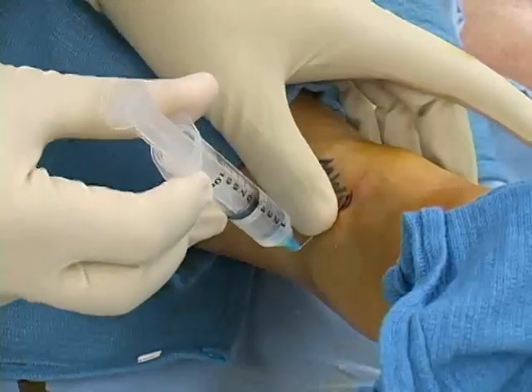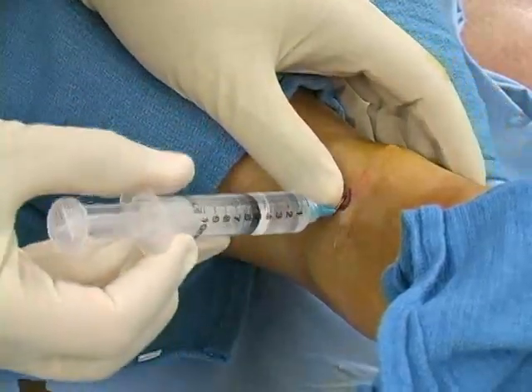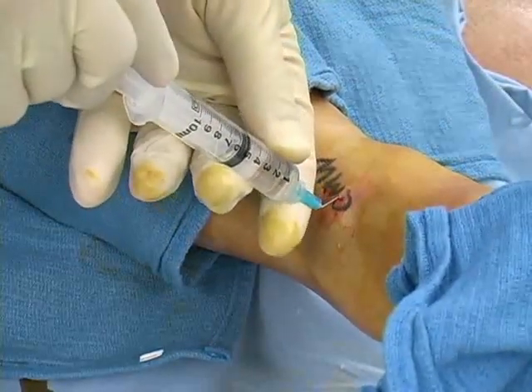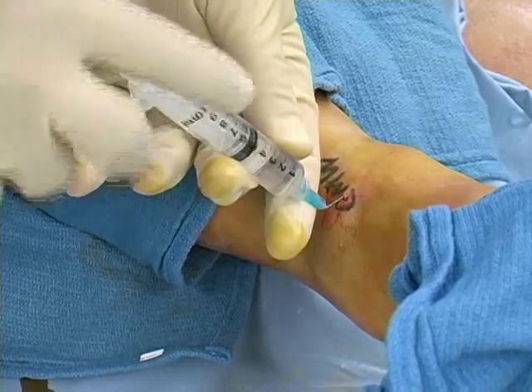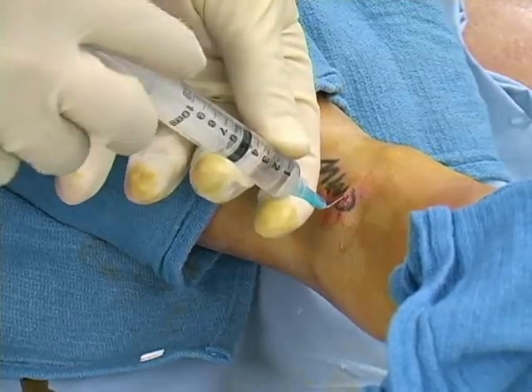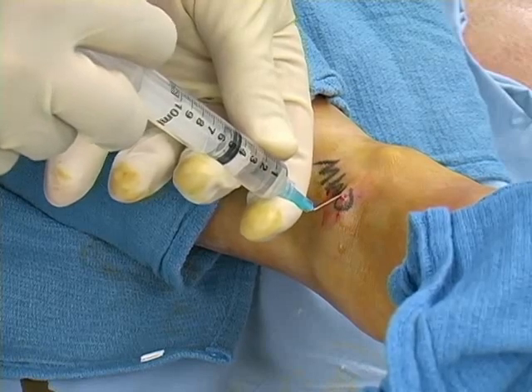Redirect the needle, this time toward the medial malleolus. In a technique similar to the superficial peroneal block, inject five milliliters of local anesthetic, starting at the medial malleolus and ending with the needle tip at the anterior tibial ridge.